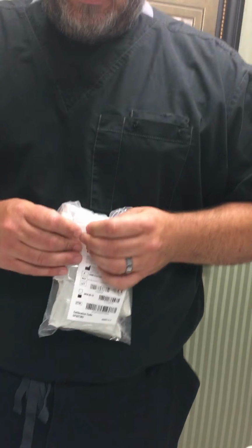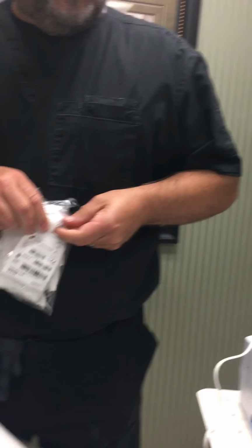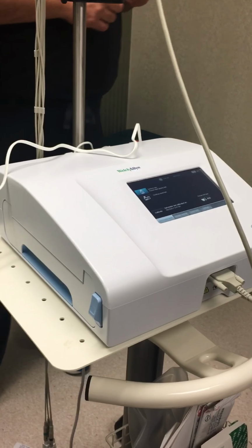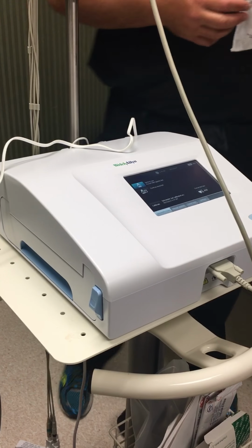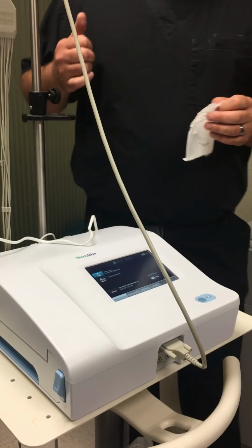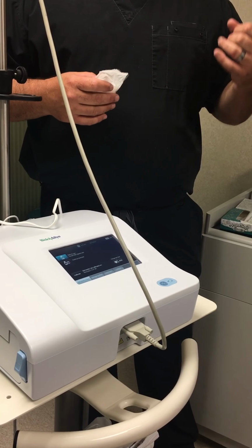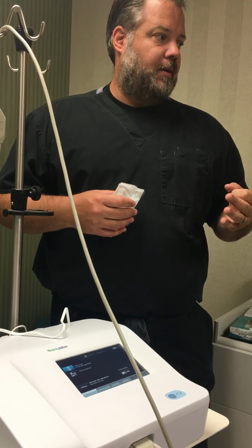Practice one. The one thing I will tell you, like I said before, is that spirometry is not a fun test. It's a lot of effort dependency on the patient's part. If you show them, they'll hear it, they'll see it, they'll understand it better.